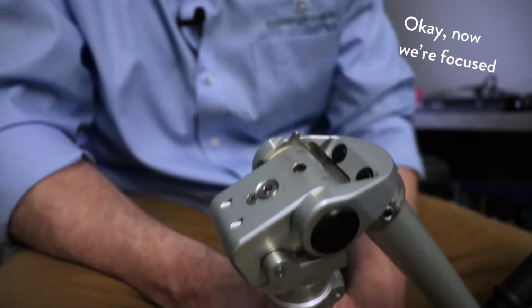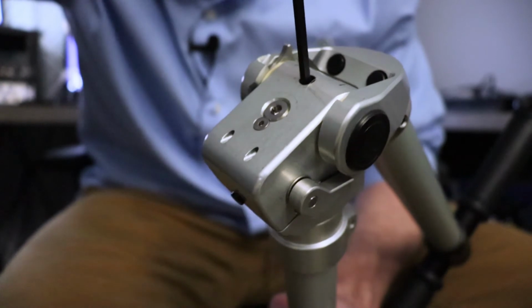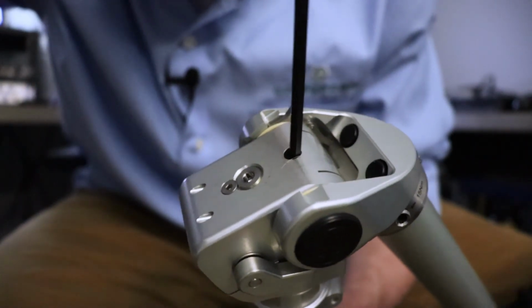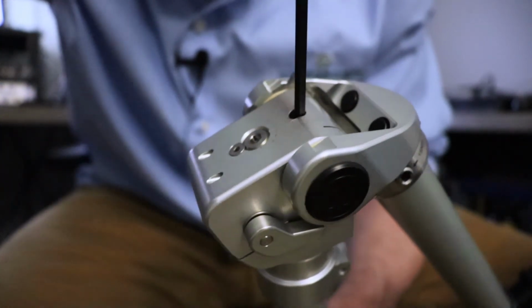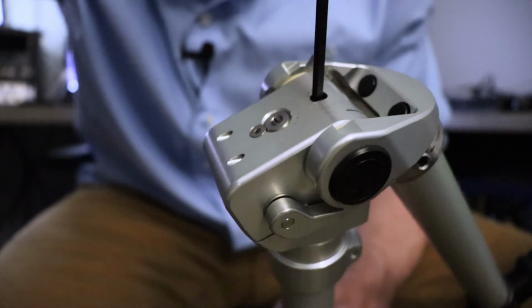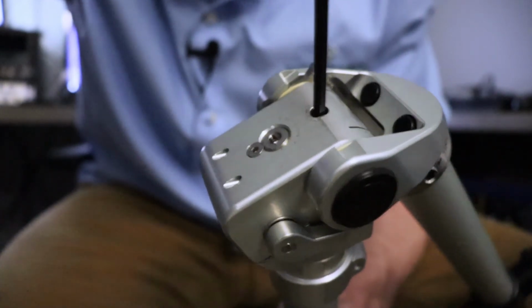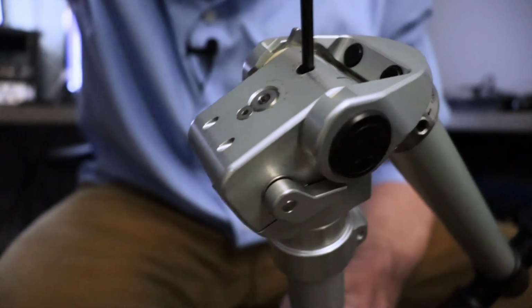Now if you're having trouble getting your wrench seated in there, it is at a little bit of an angle. So if I go straight in there, it does have to sort of fall into place. If you can see the angle of it, it's not a total straight shot. And if you're turning your wrench and you feel some resistance, good, you're in there. If not, if it's in there but it's just sort of spinning around, you're not in that fastener. So you gotta make sure you get seated in there. See, sometimes you can hear it click. There you go. Now you're in.